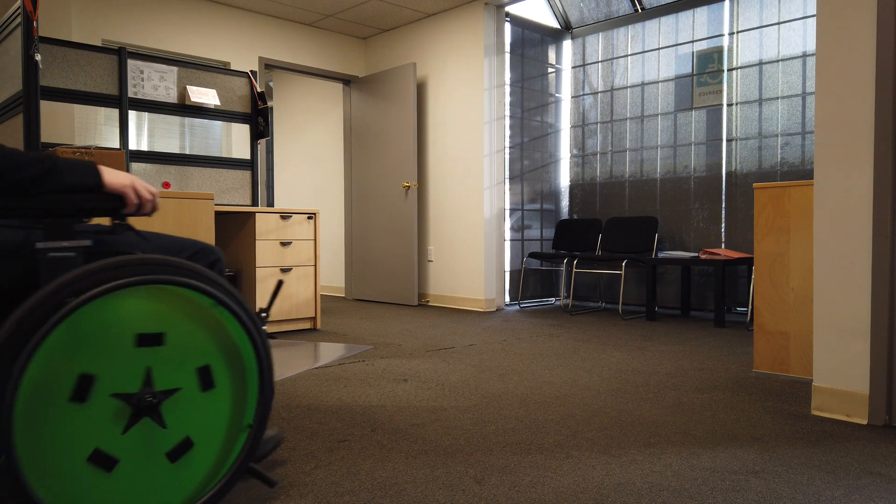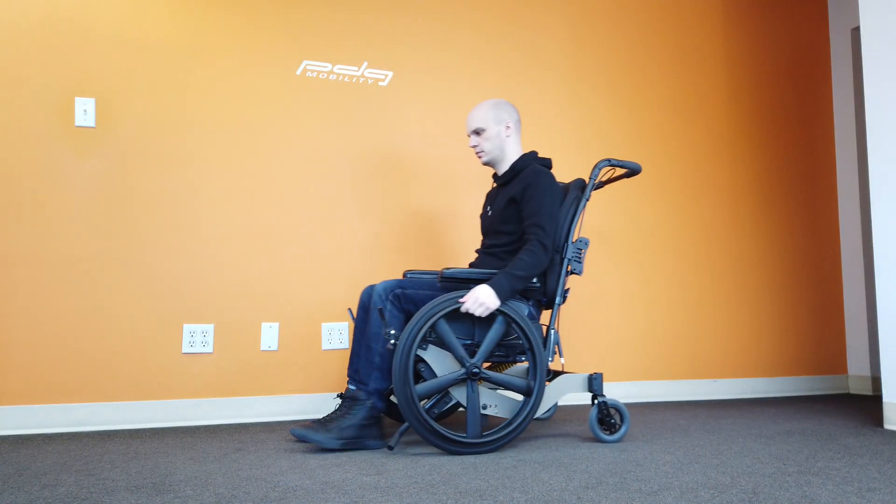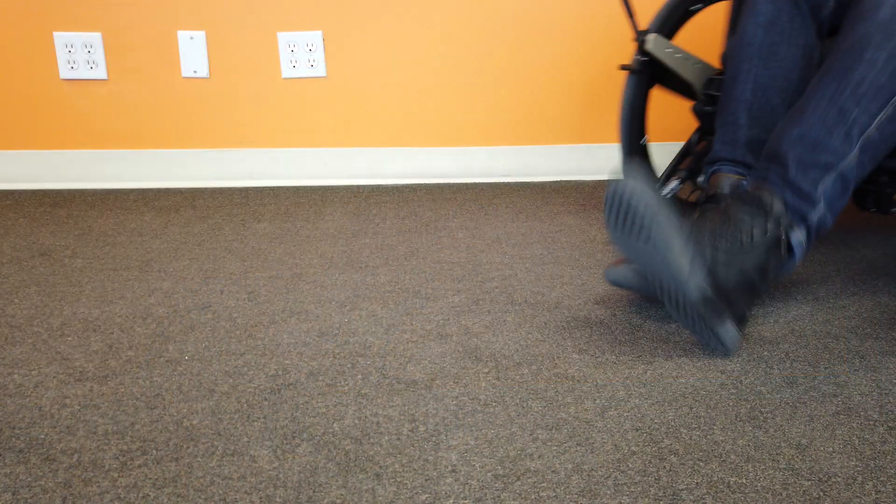The Bentley LTR has also been designed with foot propulsion in mind. Maintaining the same zero knee-rise tilt as the other wheelchairs in the Bentley lineup, the Bentley LTR allows for superior foot propulsion with minimal effort, no matter the tilt setting.